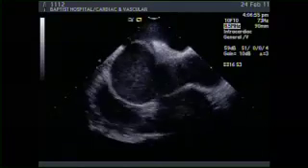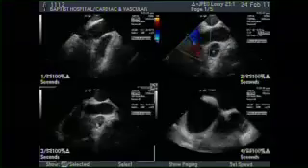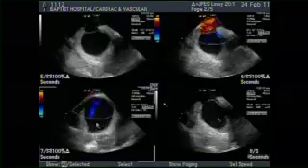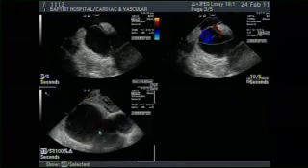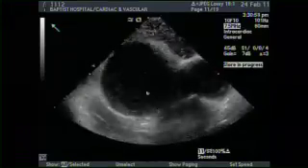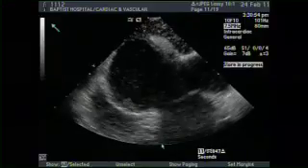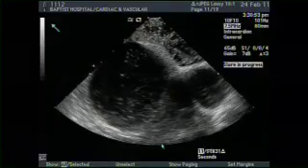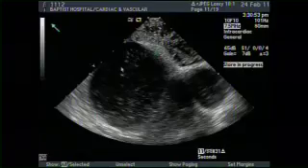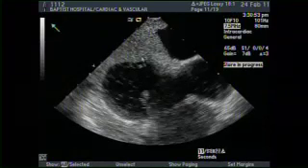The first clip that we did. So anyway, also by Doppler, you can see. Focus on the ICE, please. This is a study that we did just a few minutes ago, before we went live, to prove the point. You can see the bubbles coming from the right side of the heart and top, going into the inferior portion of this image, which is the left side of the heart, which is the left atrium, and proving that there is a communication between both sides.